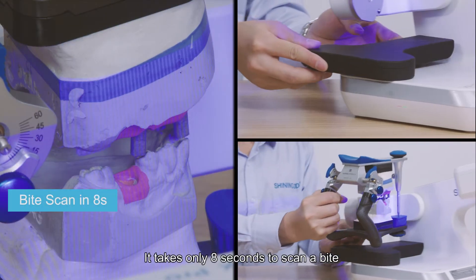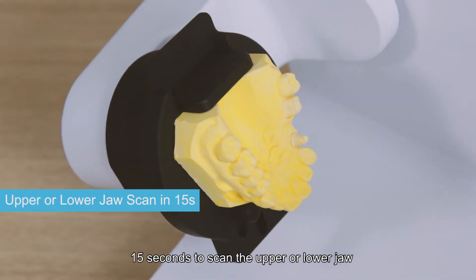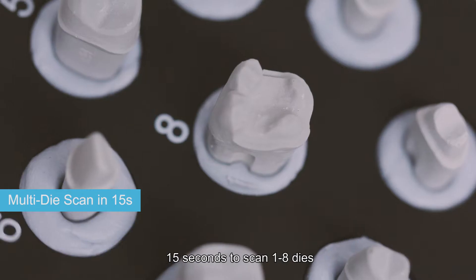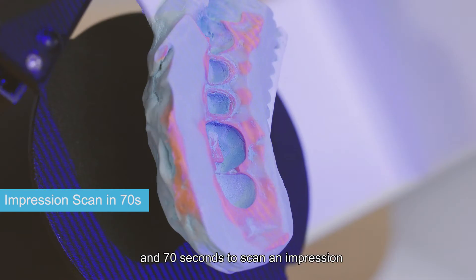It takes only 8 seconds to scan a bite, 15 seconds to scan the upper or lower jaw, 15 seconds to scan 1 to 8 dies, and 70 seconds to scan an impression.